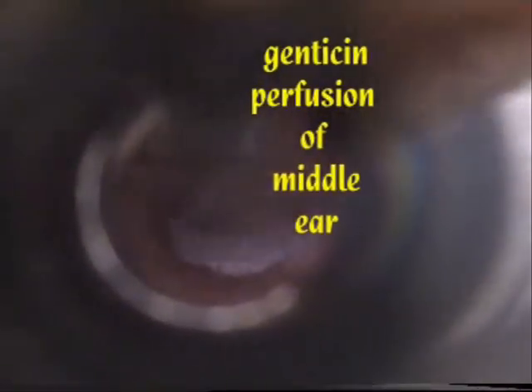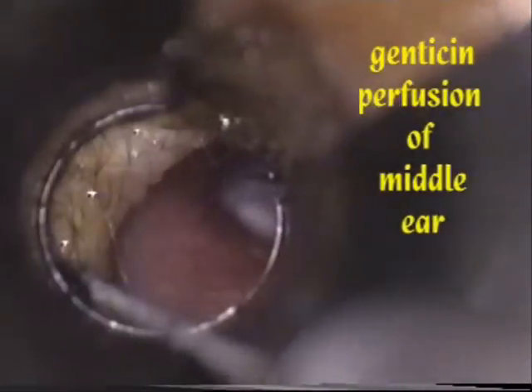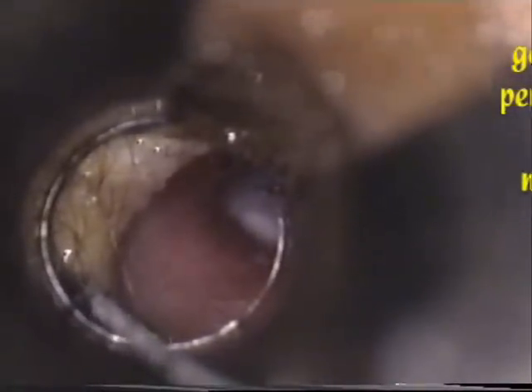In this video clip, I, Dr. Ravi Ramalingam, will show you the technique of gentamicin perfusion of the middle ear for Meniere's disease. This can be done at least 3 to 6 times to achieve the desired result — that is, control of the disease spells in early Meniere's disease. Done under local anesthesia.